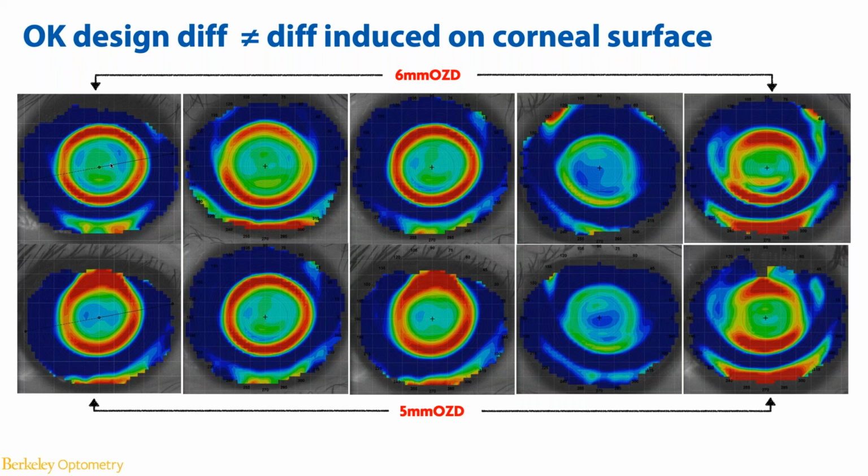Excellent, thank you. And another question in terms of fitting the 5mm design, because the extra 1mm that was essentially taken away from the width of the optic zone was then redistributed to the landing zone angle zone of the lens, do you change how you fit the landing zone because you're utilizing a 5mm OZD? This is such a great question. It shows that this doctor probably used a lot of CRT lenses.